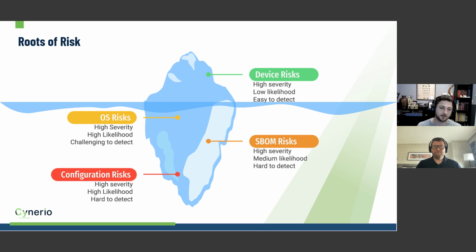If you look at something like the WannaCry EternalBlue events of 2017, those are all older Windows devices. There are a lot of older Windows devices in hospitals that are still susceptible to those kinds of attacks, or actually to that exact same attack that a lot of different organizations were affected by in 2017.